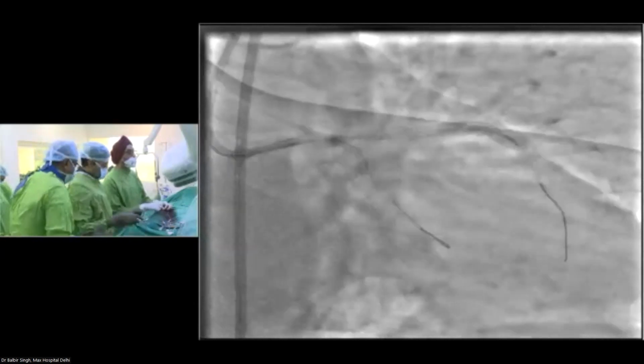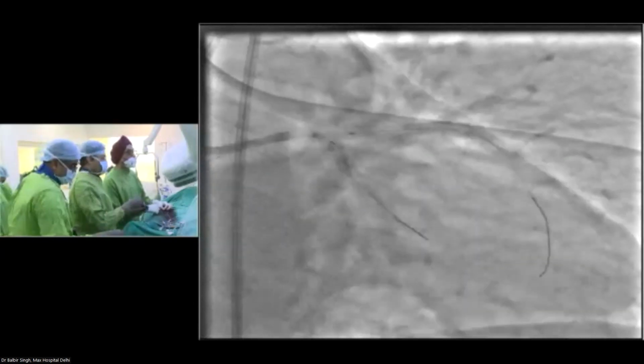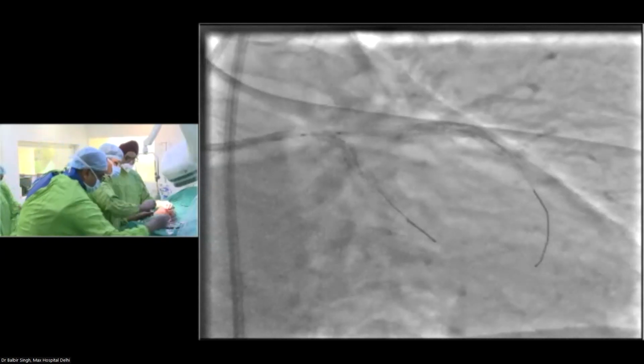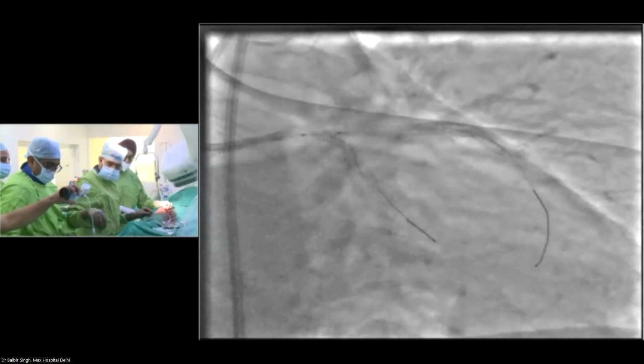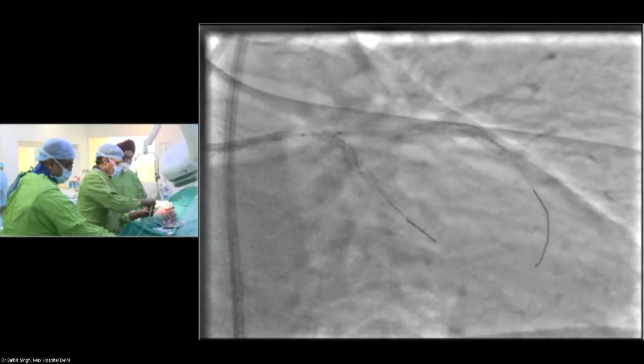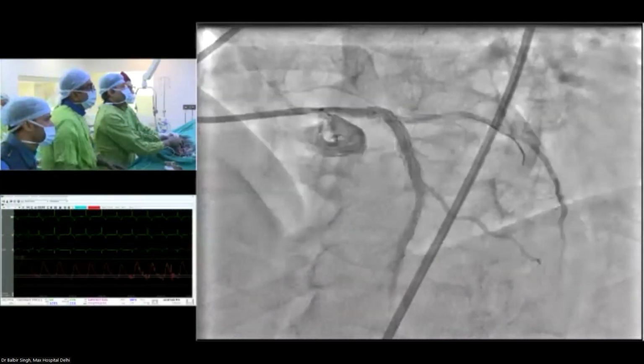So I think once Dr. Singh is able to cross, we'll probably have to run over to Hyderabad, because Dr. Ravi has something to show us with the laser as well. Anji, stent boost, I think almost done, and wants to show us a few things.